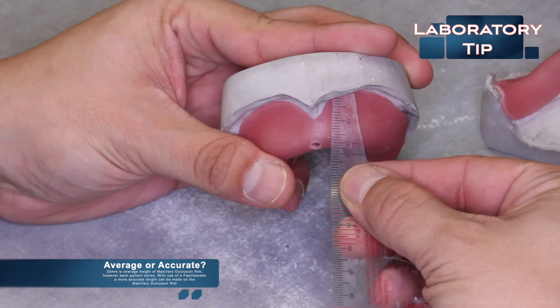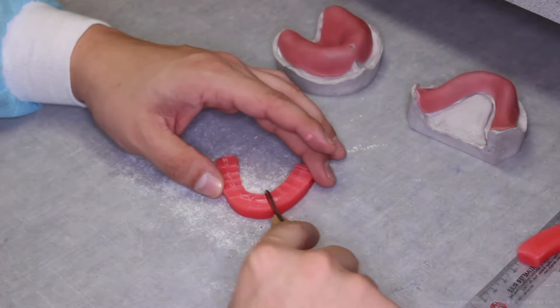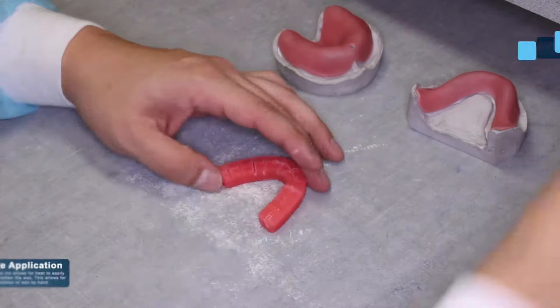Once the record bases are completed, it is time to fabricate the occlusion rims. Preformed wax rims can be used. The Air Force manual mentions two other methods: folding of a base plate wax or using an occlusion rim form. A tip for adapting the occlusion rim to the record base is to cut into the wax — this allows heat to easily penetrate and soften it, allowing for easy manipulation of the wax by hand.